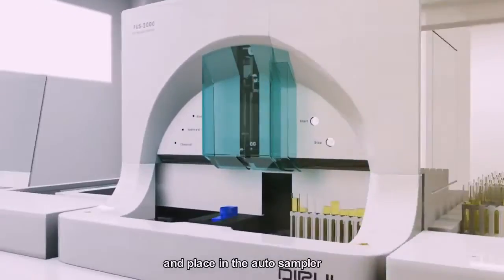Workflow of FUS-2000 Urinalysis Hybrid. Place the whole urine samples into the rack, and place in the auto-sampler. Select a test mode on the software, including dry chemistry analysis, urine sediment analysis, or combined hybrid analysis.